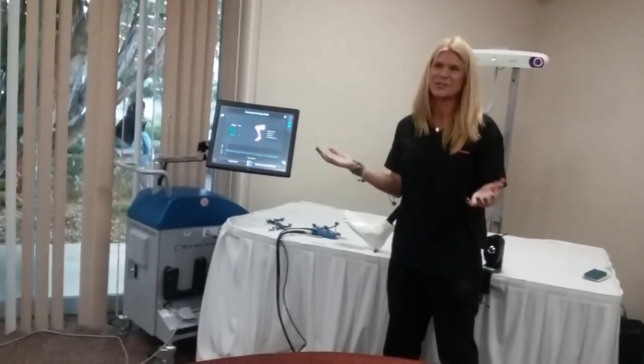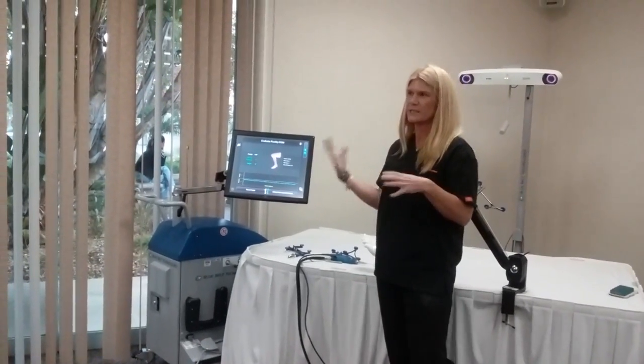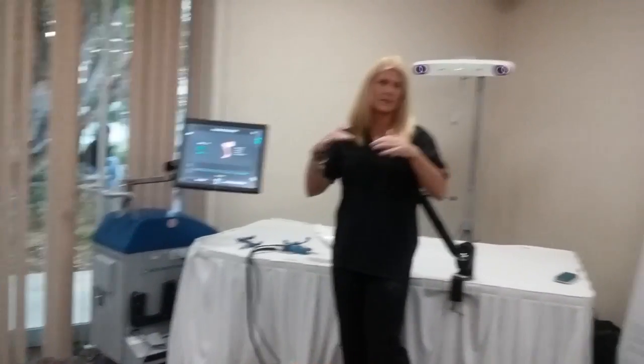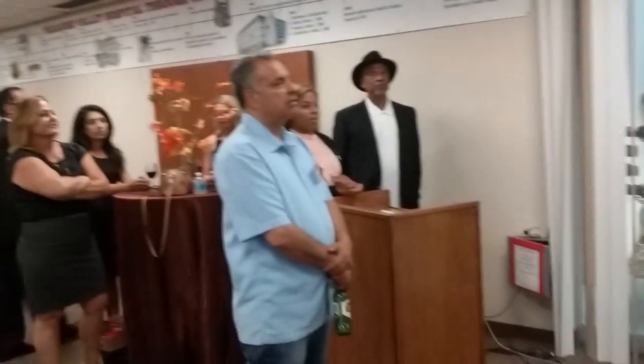Amazing. So that's essentially what a procedure is in a nutshell. The total knee is a little bit more complex, and you need different trays and stuff. So that's why I did a uni today. But the total is essentially the same thing, but you have more cut blocks because you have more bone to work with. But it's all done the same concept.